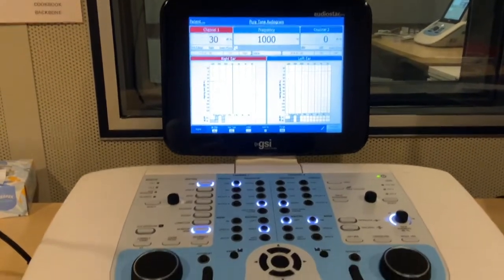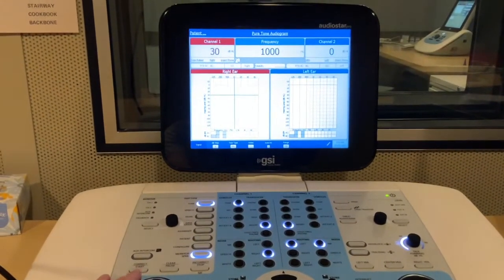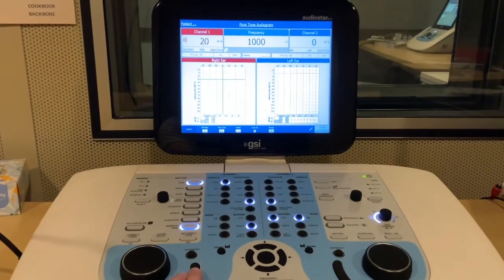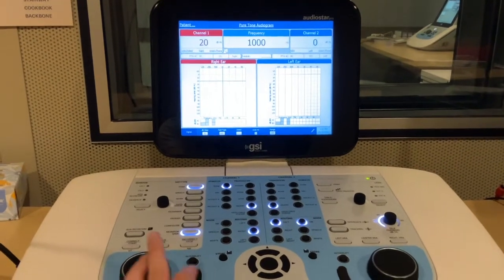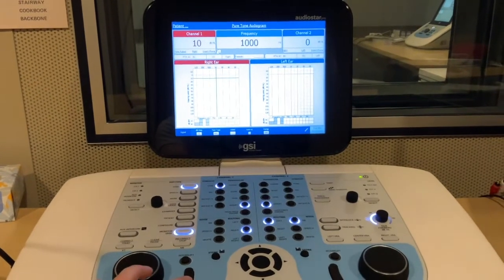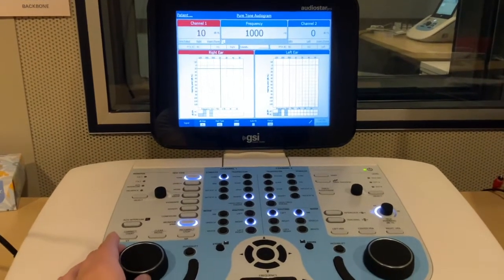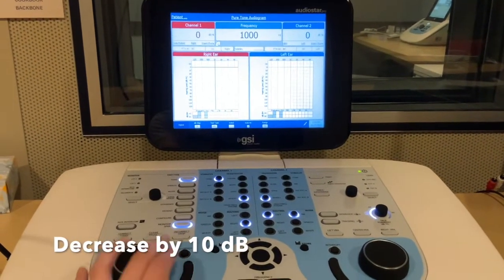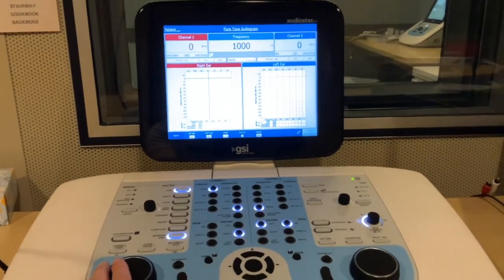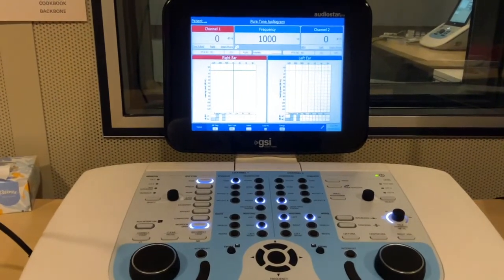So what we're going to do now is we're going to go back to our intensity knob and turn down the intensity by 10 dB and see if Emily gives us a response there. Great, we have a response. So again, we're going to go down 10 dB. Okay, another response. Let's go down 10 more dB. No response there. So now we're going to go up in steps of 5 dB when the individual doesn't give us a response.